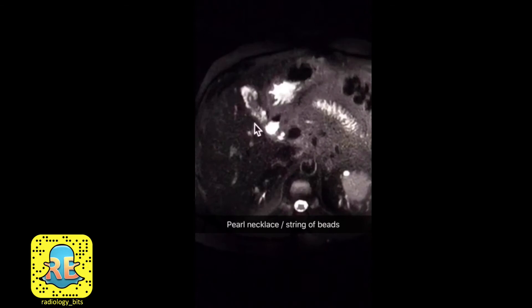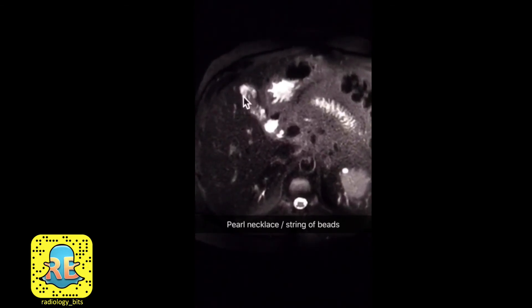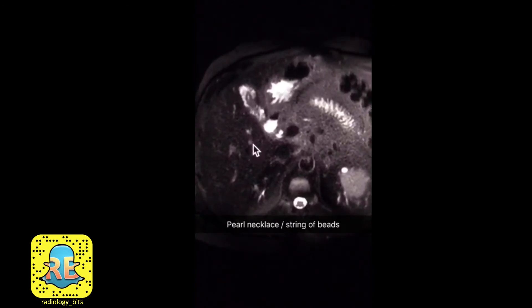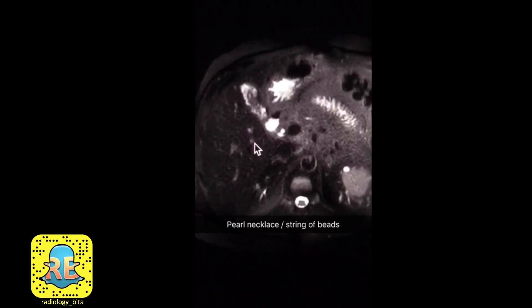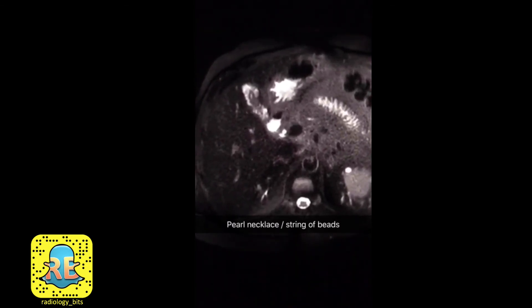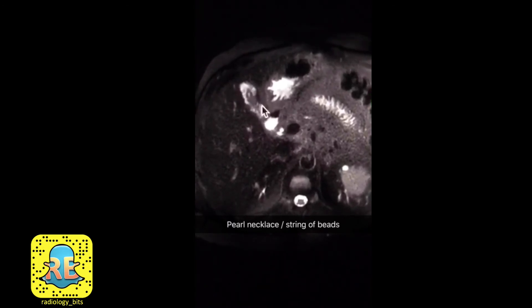Multiple cysts thickening the wall of the gallbladder. This is such a classic appearance on MRI that it has a sign attached to it — known as the pearl necklace sign or string of beads sign.